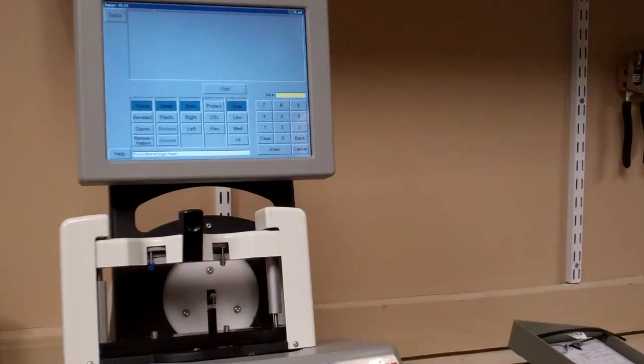This is Jason from OptiTechUSA. We're going to make a video on how to trace frames. I've got one example of each, and we're going to get started today with a metal frame.